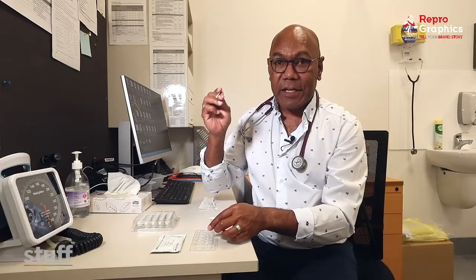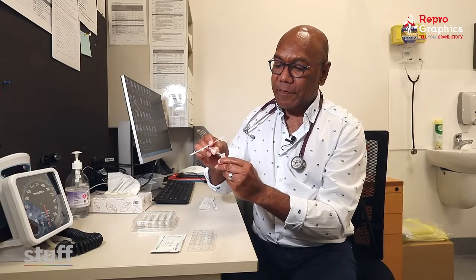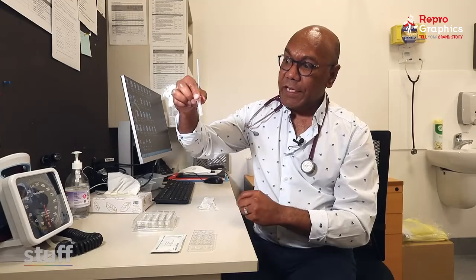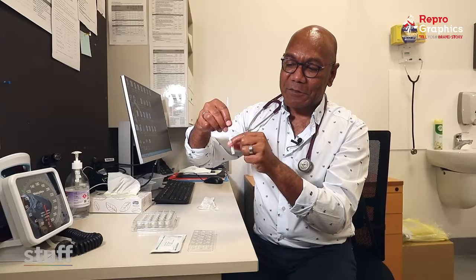Then you insert that into the solution. Open up that, put it inside, dip it right down where the solution is at the bottom, and twirl it around a few times.